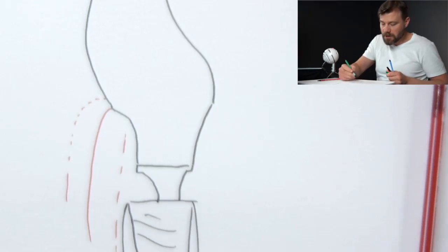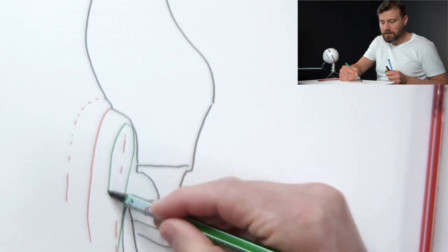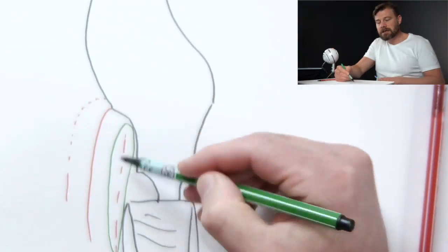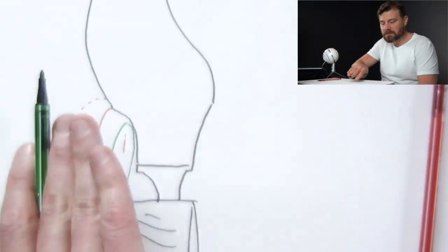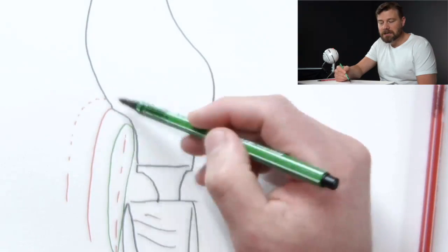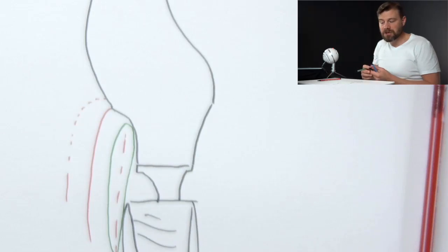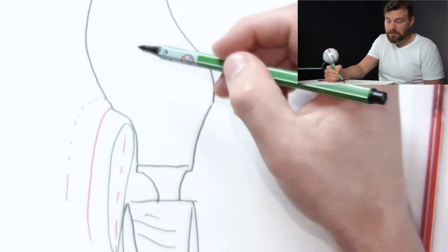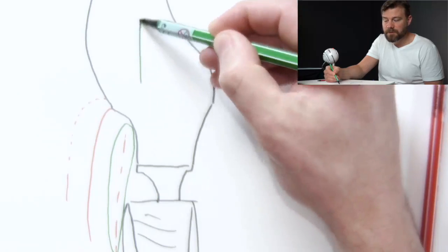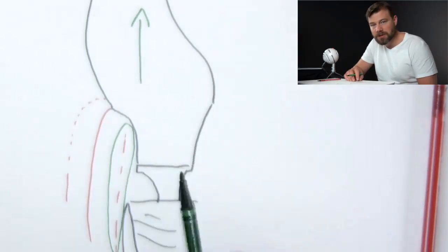You're going to struggle a lot to prepare this area exactly close to the abutment, close to the bone, without hurting a lot the entrance and the contour of the soft tissue, if you're not able to remove the crown to do this preparation.